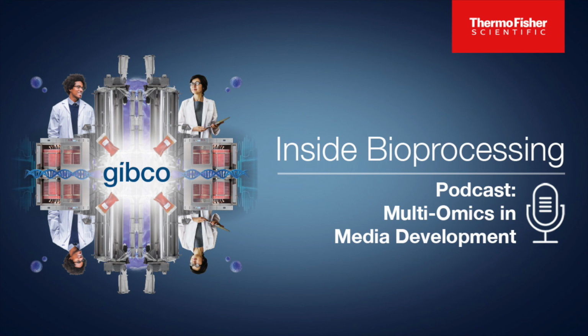in the cell culture process, where that can lead to increasing levels of lactate, increasing levels of ammonia, which then hurt the cell culture process ultimately. So that's really the limitation. It's just telling you what's going up and what's going down. It's kind of a shadow of what's actually happening. It's not really telling you what is happening.